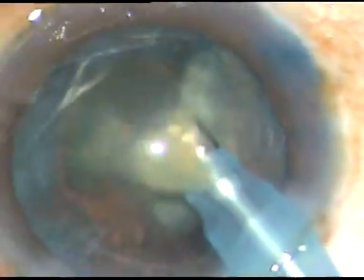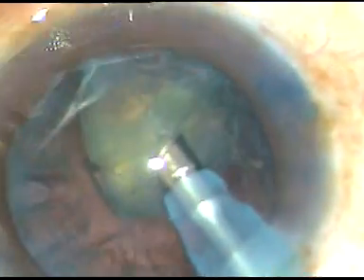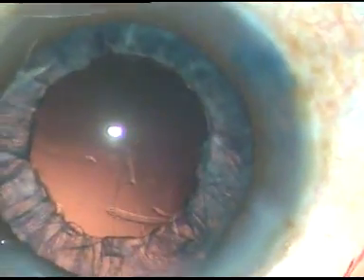This is an Oertly Cataracts 3 phaco machine. This is the last nuclear fragment. Now viscoelastic substance is injected and we can see a lot of cortical matter — it has to be removed.